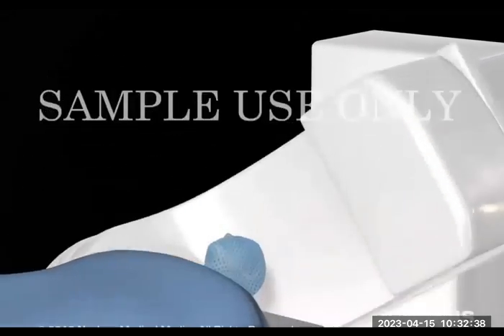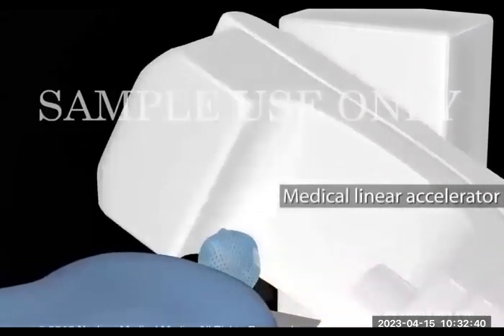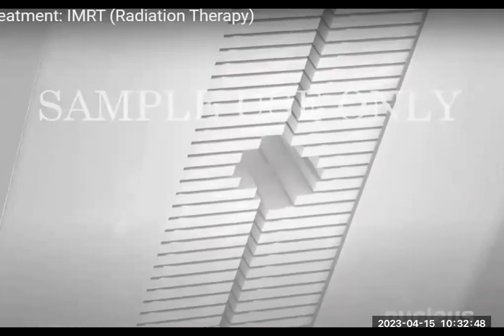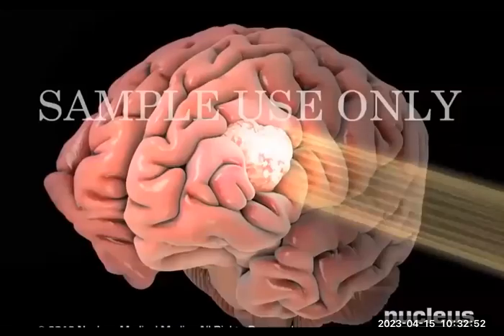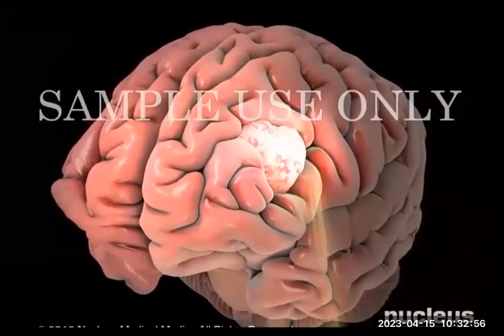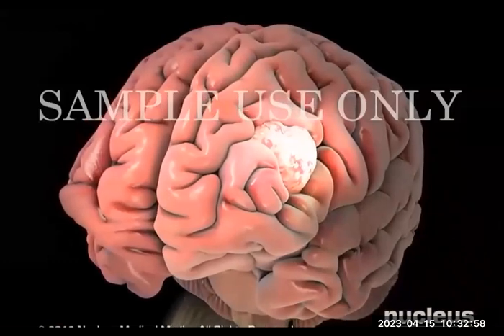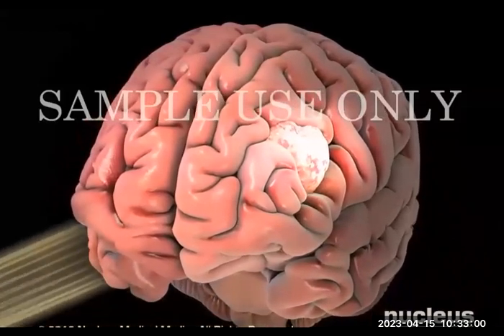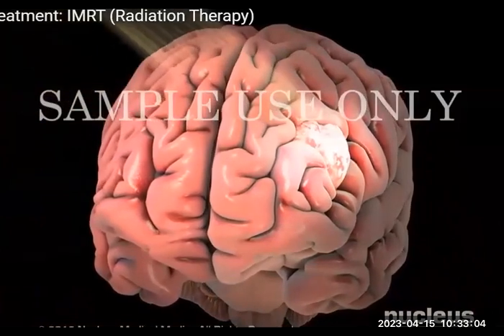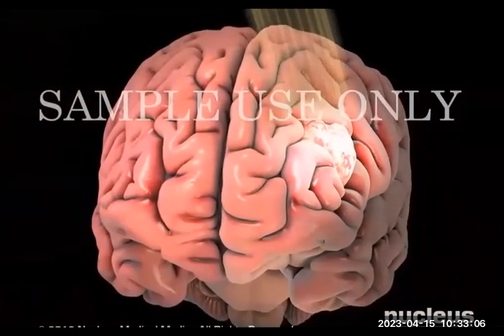During your procedure, a medical linear accelerator will deliver an X-ray beam to your tumor. A computer inside the accelerator will adjust the beam with a device called a collimator. The collimator will adjust or modulate the intensity, direction, and shape of the radiation beam. This feature allows higher doses of radiation to be delivered to your tumor while sparing your healthy tissue around it.